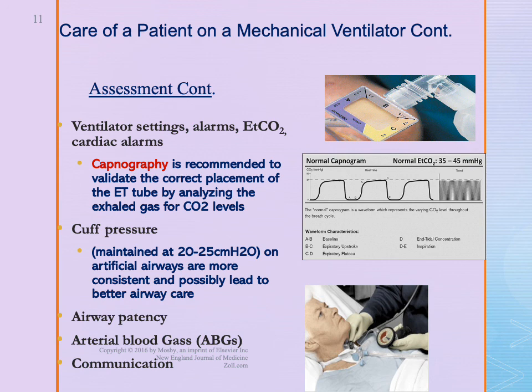The image on the top shows an end-tidal CO2 detector. The middle image shows what the waveform might look like. End-tidal CO2 is used to check for correct placement of the endotracheal tube or tracheostomy tube.